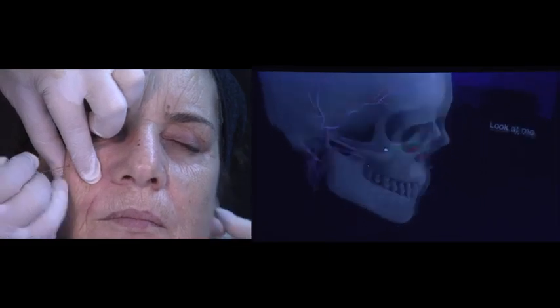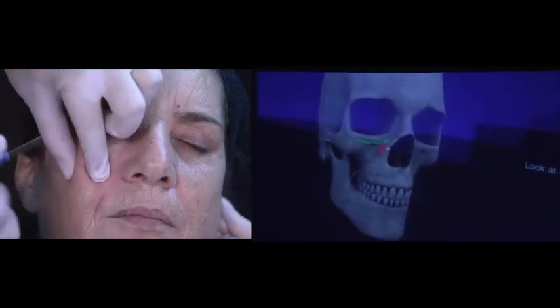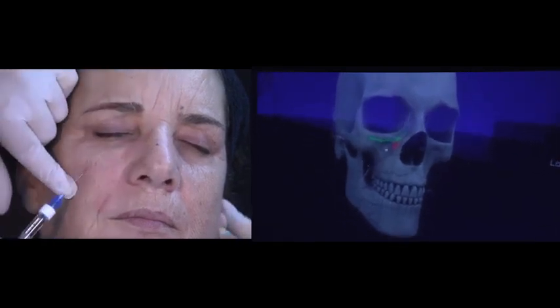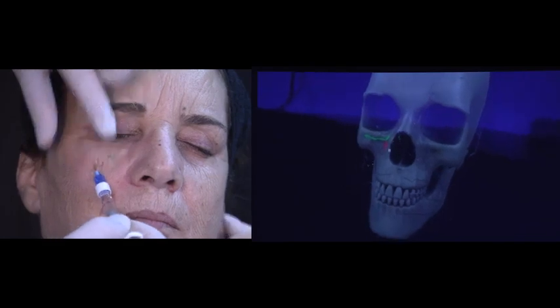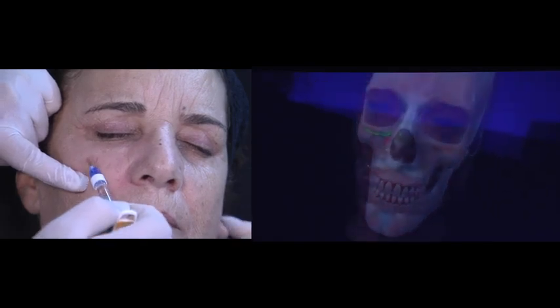So that's why it's important to think in 3D. If we move this, you will see that wherever he is, if he's deep, it doesn't matter that apparently the vessel and the vein travel around there because we are not at the same depth, and that's part of being safe. That's why having these holograms in 3D allows us to understand the depth.